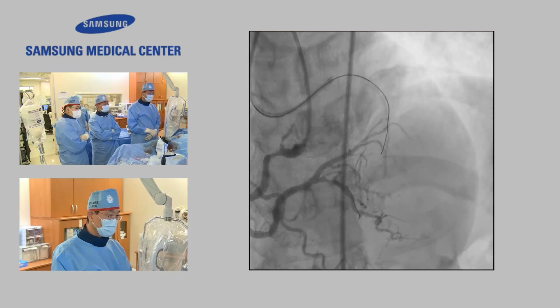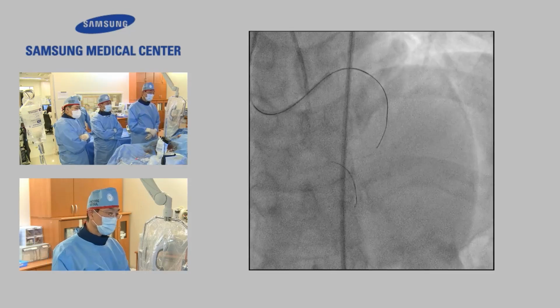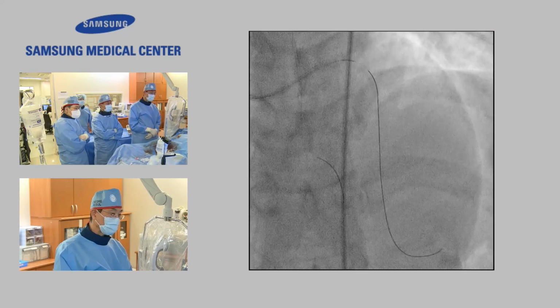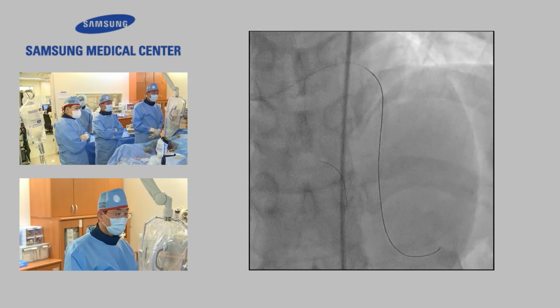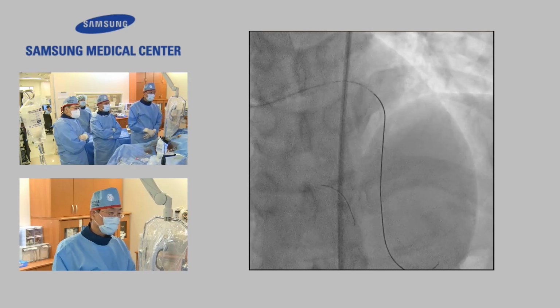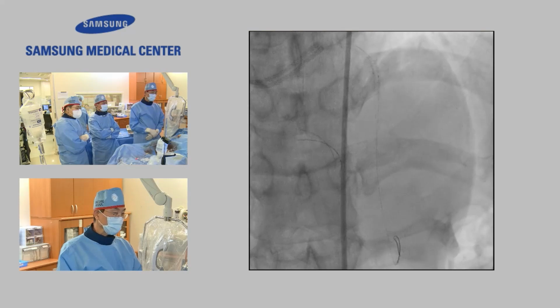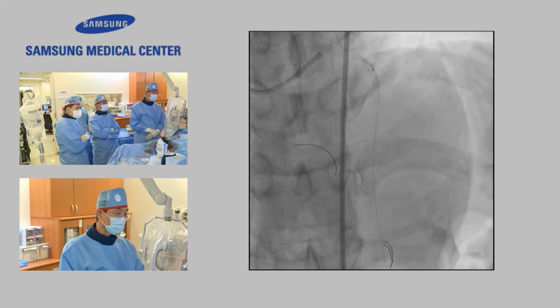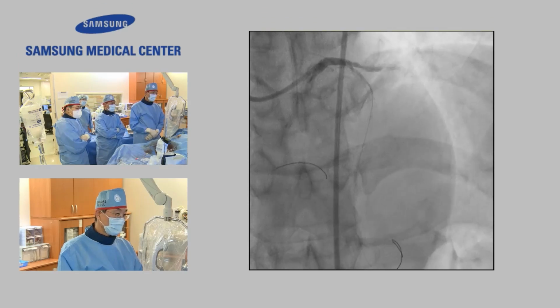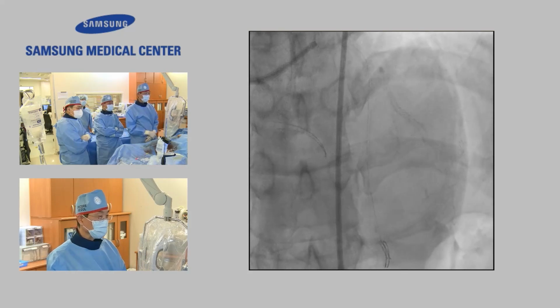The retrograde angiography. So this position is in the septal. Okay. The wire was changed to a run-through workhorse wire. Next. Yeah, ballooned it. A 1.5 by 20 millimeter balloon. So this is angiography after the 1.5 balloon.